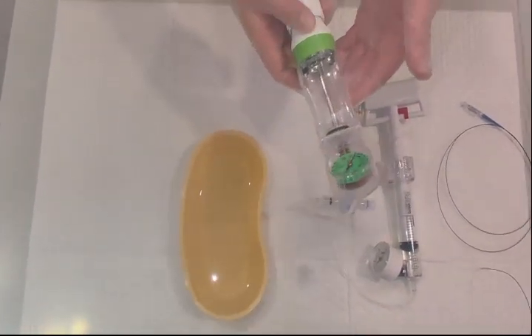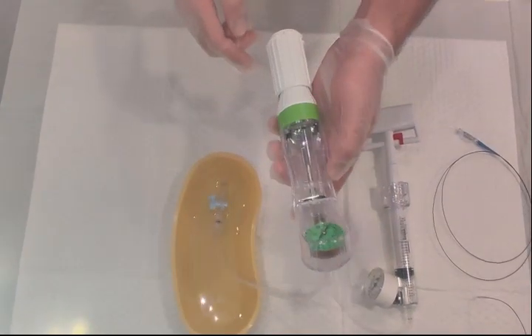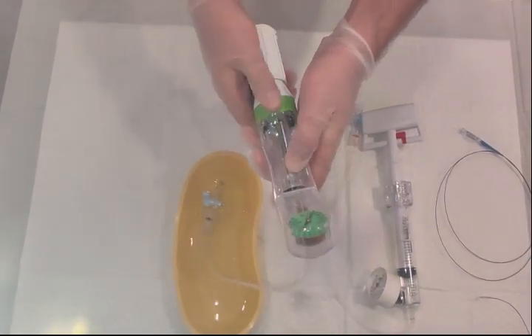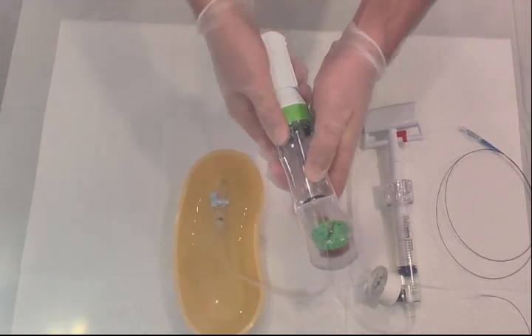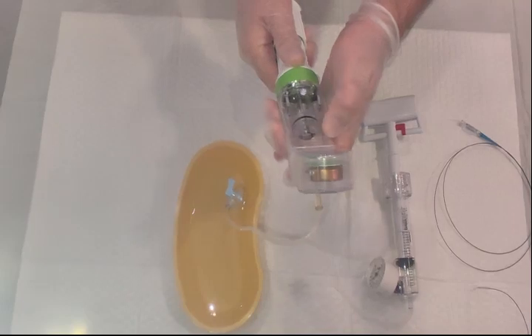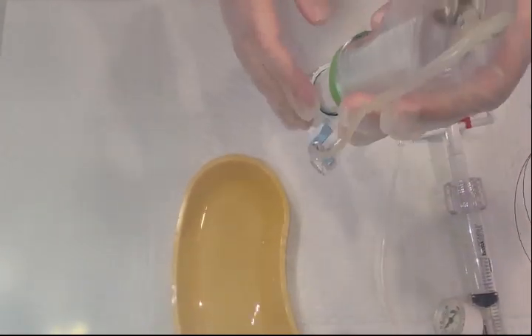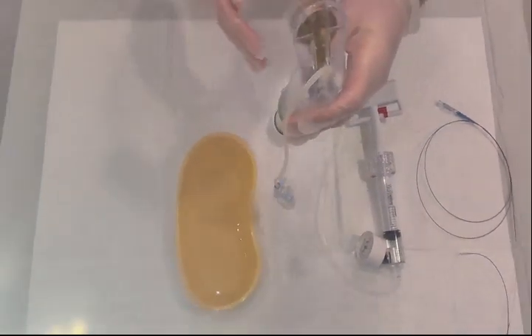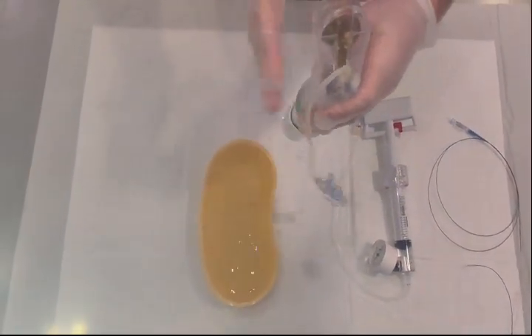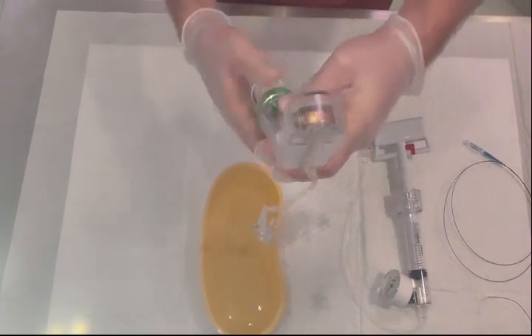Now I'll show you how to fill the second inflation device, which uses a different technique. First, unlock and retract the piston. Then fill it with contrast. Once the contrast is inside, use the same technique as before — move it upright to release any potential air — then lock it.